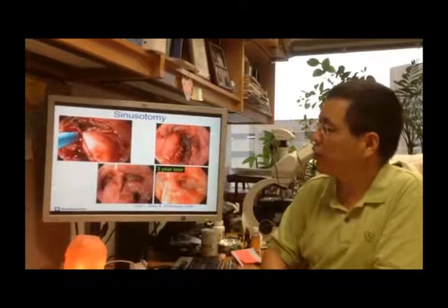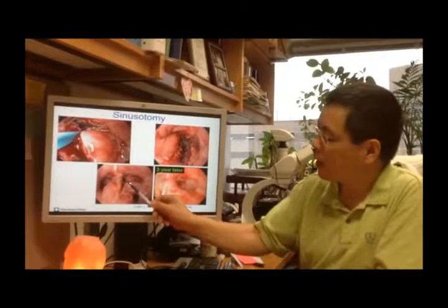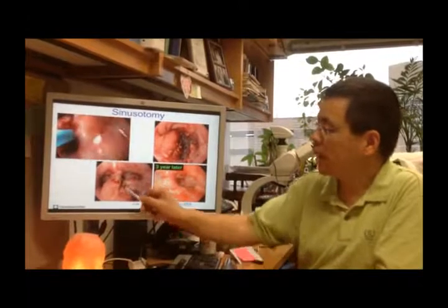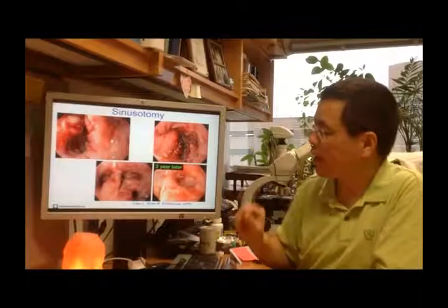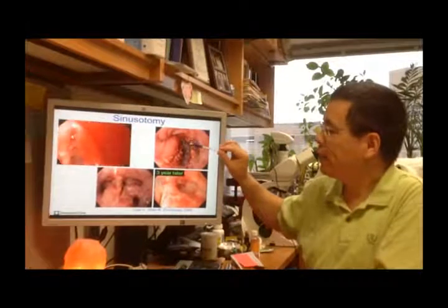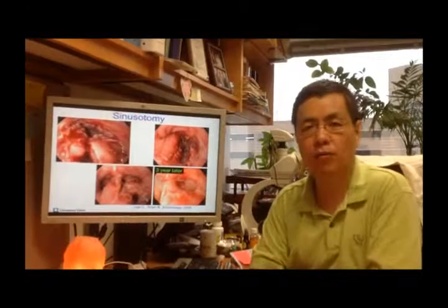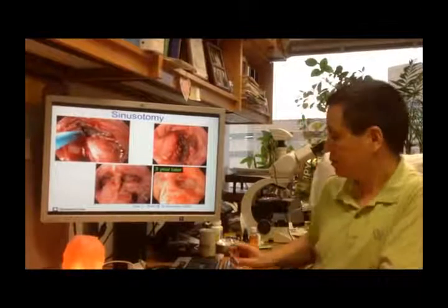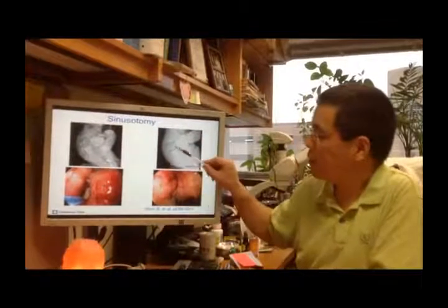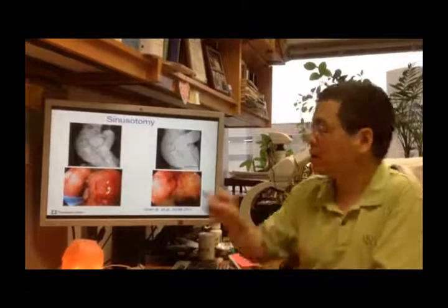Here is a short video about the procedure. This patient has a compartmentalized sinus cavity with multiple small compartments, and here is the pouch lumen. The concept of the needle knife therapy is to combine all the small sinus cavities into one large cavity. Those areas will later be replaced by epithelium from the pouch body. For complex pouch sinus with multiple therapies, after more than 10 sessions of endoscopic therapy, the sinus was cured.